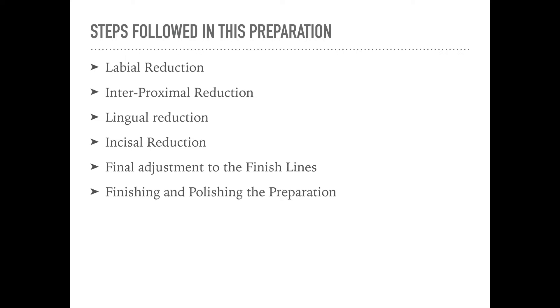I keep the incisal reduction towards the end, and I explain later in this video why I choose to do that. Once reduction is done on all aspects, I do the final adjustment to the finish lines — depending on whether I keep it equi-gingival or sub-gingival. At the end, as usual for every preparation, you have to finish and polish the preparation.